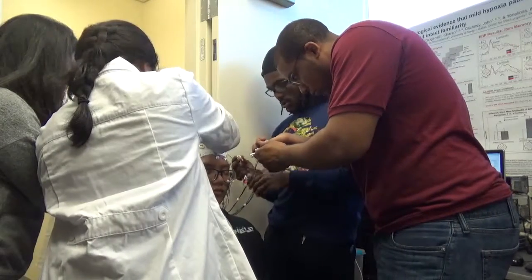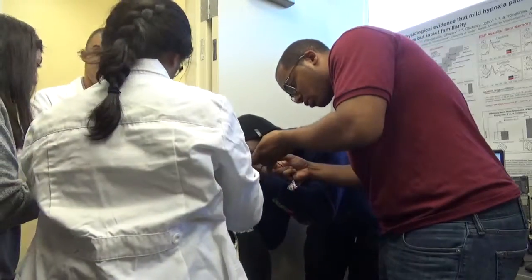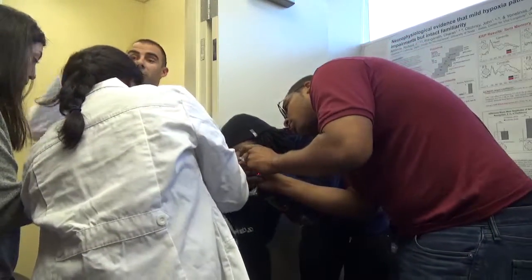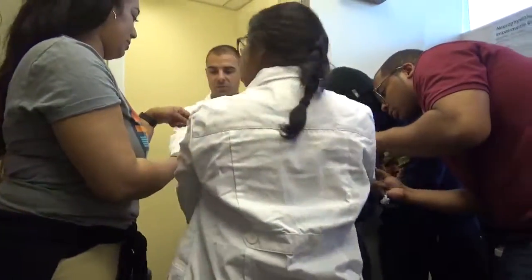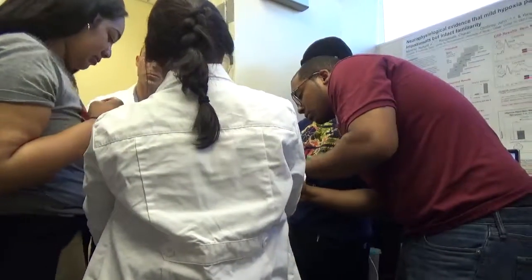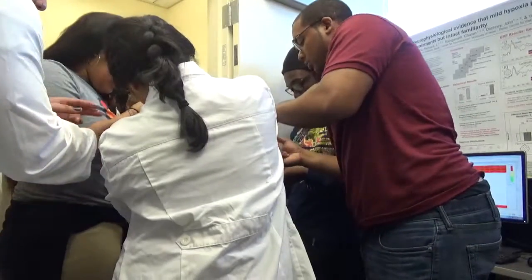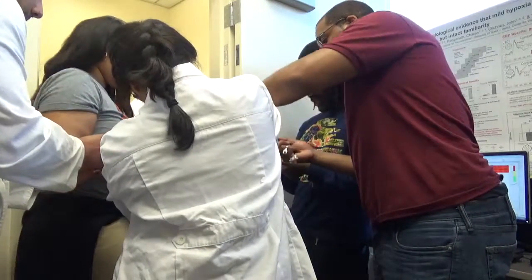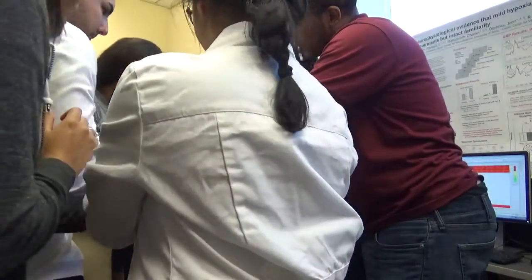There's room over here if you guys want to come in. And you guys want to plug a few in? You guys want to rotate in? You can grab some of these. Here, I'll let you start. Somebody, you want to do these? And somebody else can do those. Somebody else want to come in? We got a couple extras. Anyone else? Watch the wires, nobody tripping over them. Do any of you guys want to try? Is it like this?